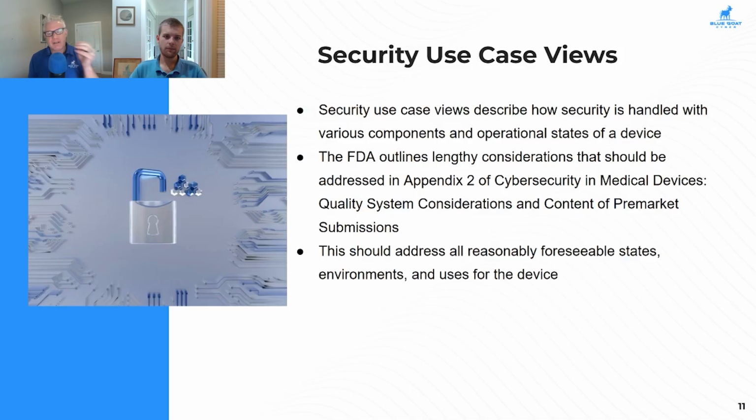So a state would be like, because some of the devices we work with are in kiosk mode, but while they're booting up, they're not quite in kiosk mode until that function is enabled. So there's a window of time to exploit that device before kiosk mode comes up. So we're looking at all these sort of cases, right?